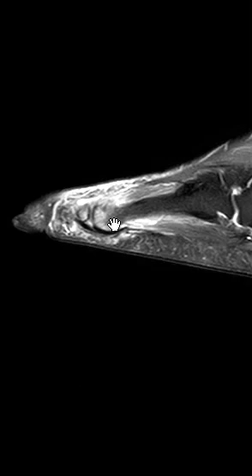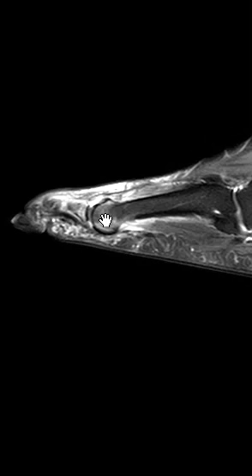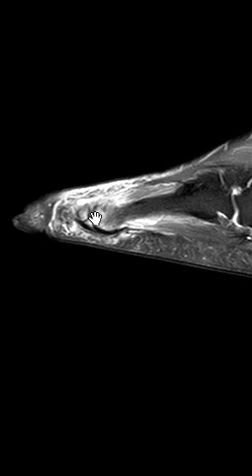Now here we are at the joint. We see the fourth metatarsal head. There's marrow edema pretty much along the subarticular region and plantar aspect, and the toe is showing prominent marrow edema.